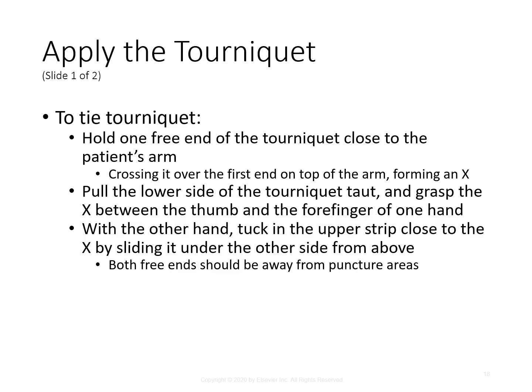So it takes a little bit of time, honestly, to figure out how to do a tourniquet appropriately. So you will get time to practice that. So no need to worry there. But just know that you may not get it on the first try.